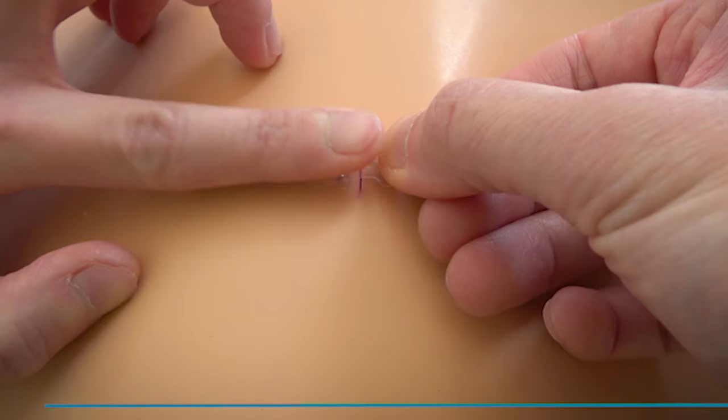Press over the microstaple area on the same side as the tab while pulling laterally to remove it. Press firmly on both sides to secure Micromend to the skin.